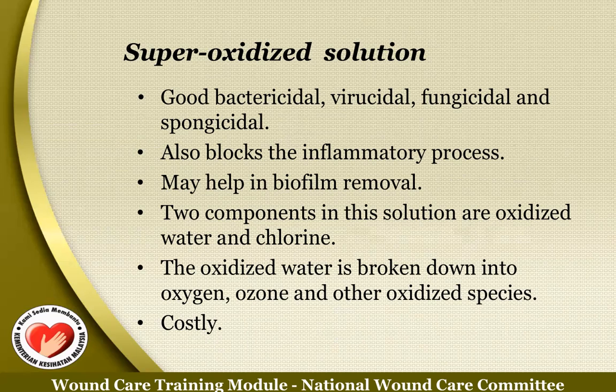It can block the inflammatory process, remove the biofilm, which is also a foreign object that prevents the healing process. Two components of this solution are oxidized water and chlorine. Oxidized water can be broken down to oxygen, ozone, and other oxidized species. Why is this not usually used? Because we have to buy it and it's costly.